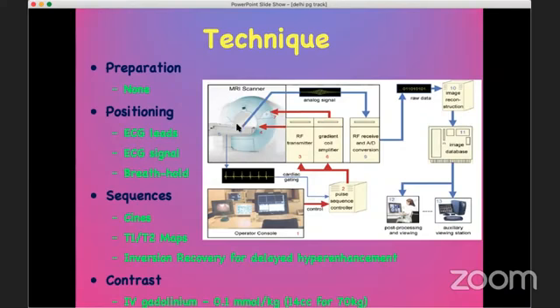Now, the signals that come are from the special coil that we use. We have different coils for different parts. And this analog signal comes to the receiver and then gets converted in an image reconstruction unit, which is inbuilt in the system, which then transfers the raw data into the imaging database. And that's when imagers like us look at it, and from the raw data we are able to see the sequences and the images.